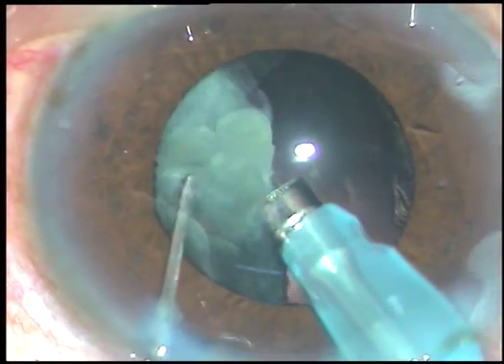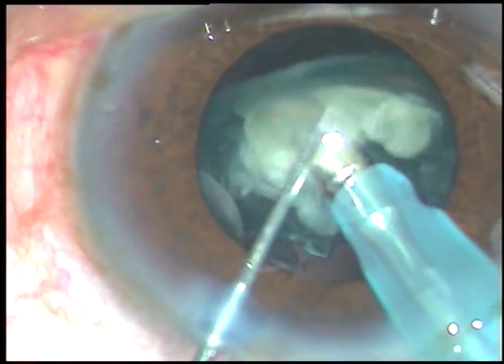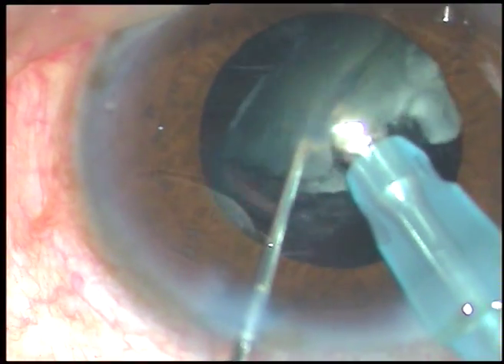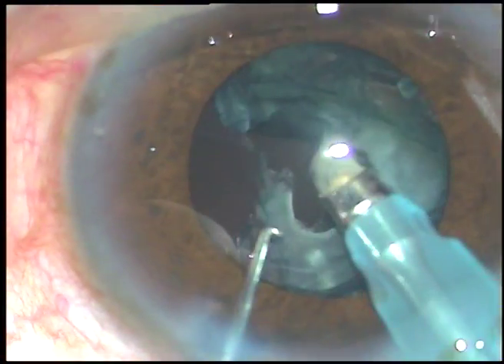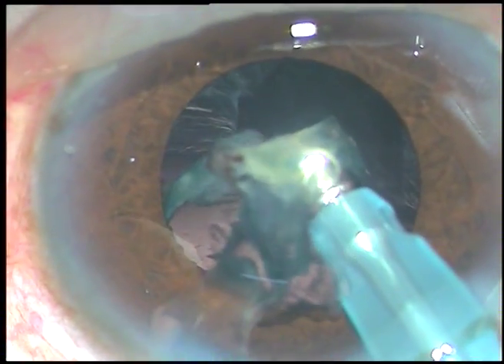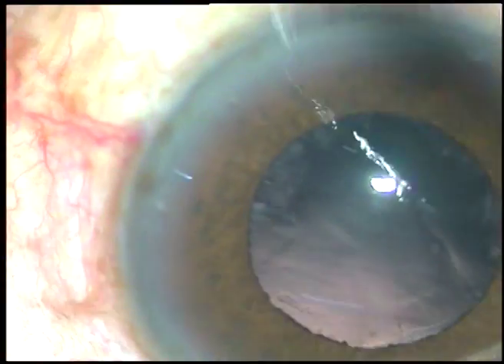So, this is the last nuclear fragment — and that's it. The nucleus is managed. The epinucleus has also come out.